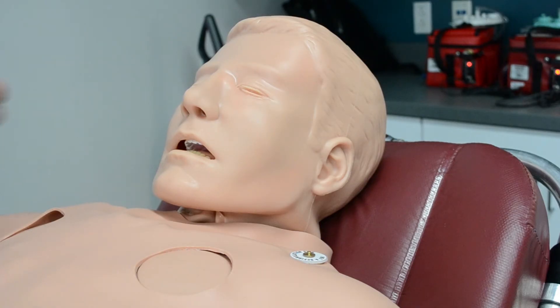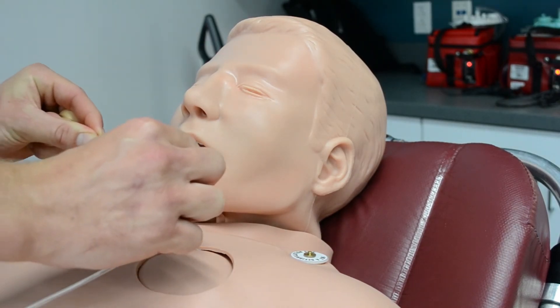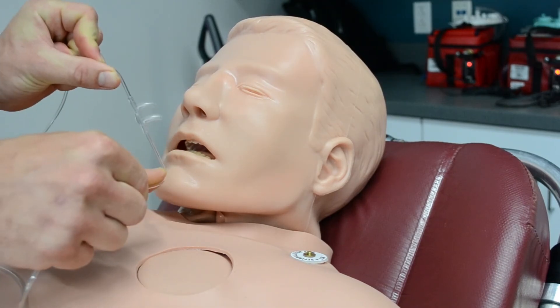We've got our patient here. We've decided to provide some supplemental oxygen with a nasal cannula. The proper way to apply this is to pull so that the two flares of the nasal cannula are tight in between your fingers, to slide those into the nostrils.